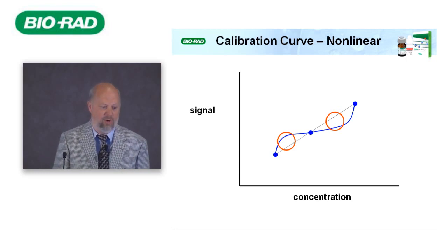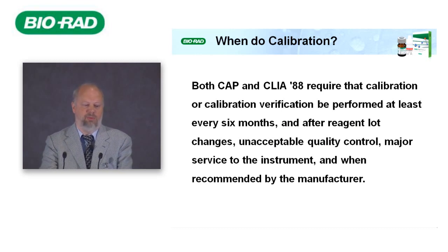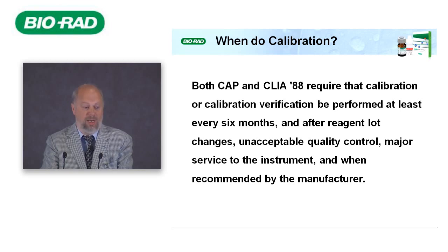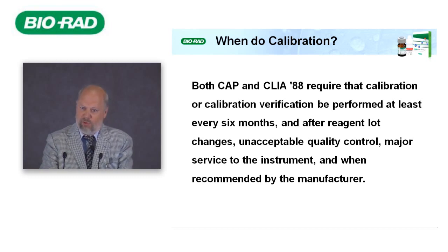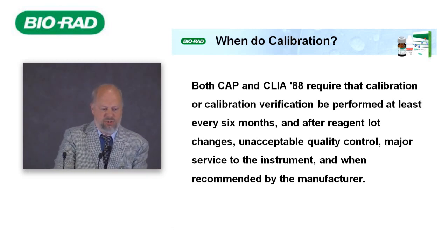Both CAP and CLIA require that calibration or calibration verification be performed at least every six months, and after reagent lot changes. Most laboratories are not doing this after lot changes. Unacceptable quality control does not mean simply having a value outside your limits — you have to find a reason before doing a calibration. These days people look at the QC result and then calibrate, effectively calibrating the error away and forgetting it. Major service of the instrument also requires calibration, and whenever recommended by the manufacturer.